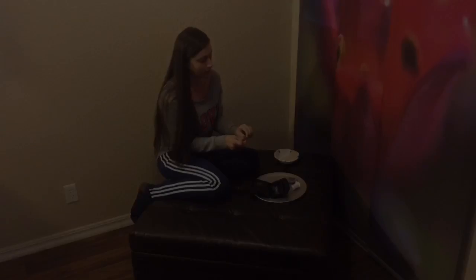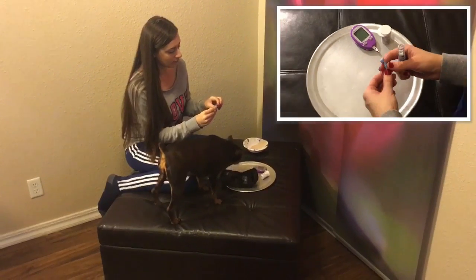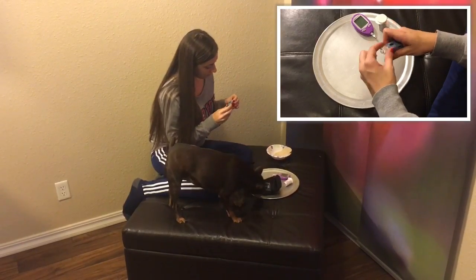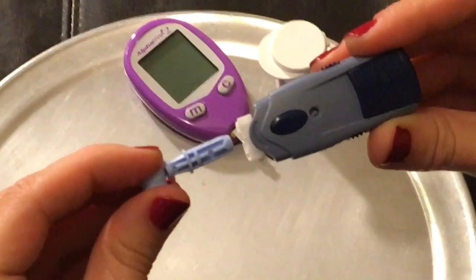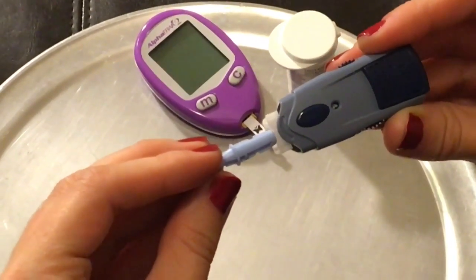To us, prepping the lancet is the most important part of this whole thing, because we love this glucose monitor kit, but we do not like this lancet. It has given us a lot of problems. Most of the other owners that we've talked to have the same problems with it not drawing enough blood — sometimes not any blood at all. So what me and Penny figured out was this little secret.